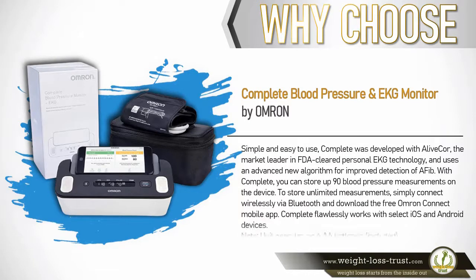Complete was developed with AliveCor, the market leader in FDA-cleared personal EKG technology, and uses an advanced new algorithm for improved detection of atrial fibrillation. With Complete, you can store up to 90 blood pressure measurements on the device. To store unlimited measurements, simply connect wirelessly via Bluetooth and download the free Omron Connect mobile app. Complete flawlessly works with select iOS and Android devices. Note: unit operates on four double-A batteries, included.